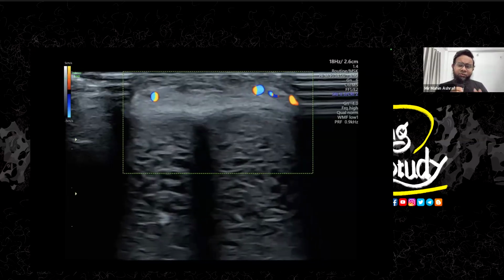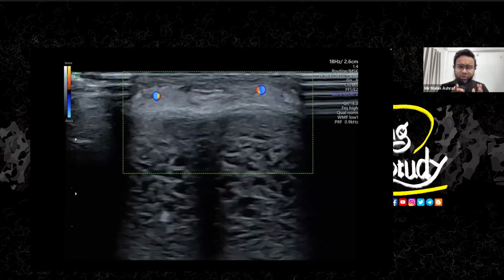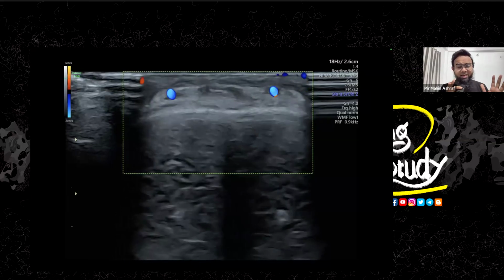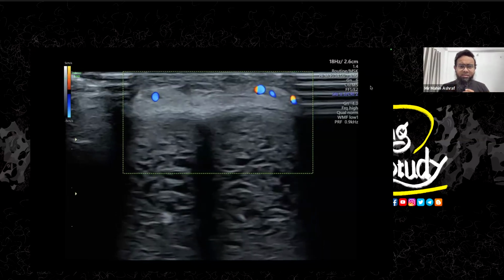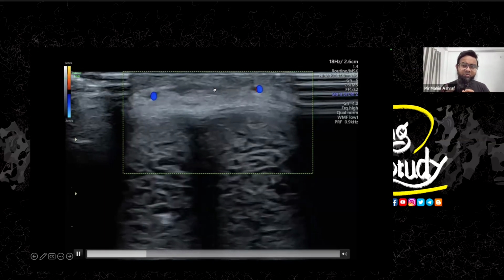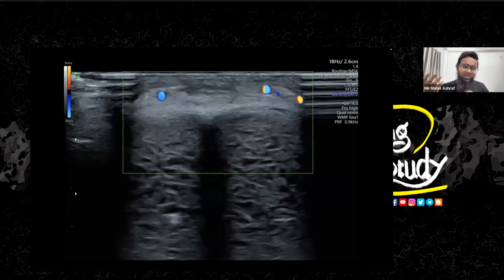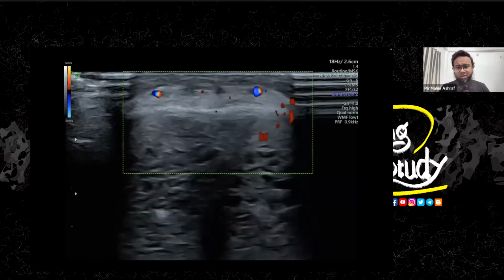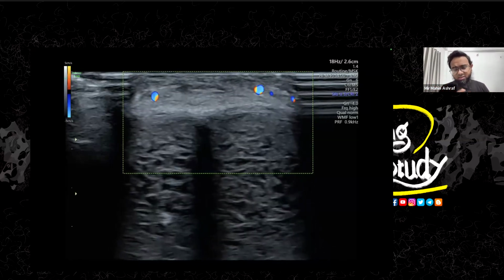In case of thrombosis of the venous sinusoids, these arteries play a role to supply the skin and surrounding glands and surrounding areas as much as possible. And you can see at the central part, this is the superficial dorsal penile vein. These vessels usually supply the skin and the glands, but in a critical situation, they are the main role-playing vessels.